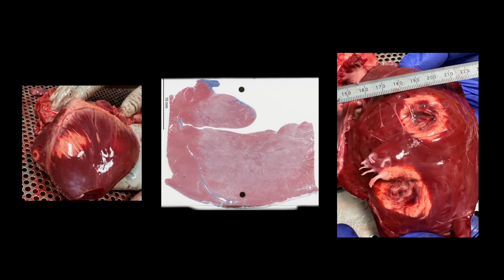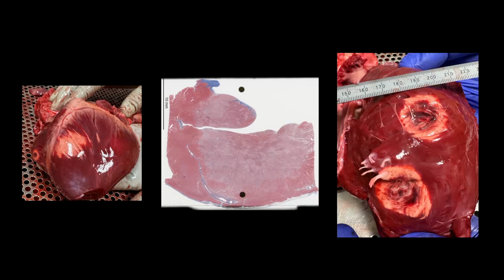On the left is an example of a large epicardial lesion. Now, this is not a lesion that was placed in the epicardium. This is actually the epicardial footprint of an endocardial lesion. And what Vivek showed in the previous talk is when you give endocardial lesions, you get this footprint of low voltage in the epicardium. And while there's this big discussion about maybe all you did was take out a channel, and that's why you lose the epicardial signals, when you see this picture, you know that the reason you're losing epicardial potentials is not because you took out a mid-myocardial channel. It's really because the electric field is penetrating 10 to 15 millimeters deep that's causing this lesion.